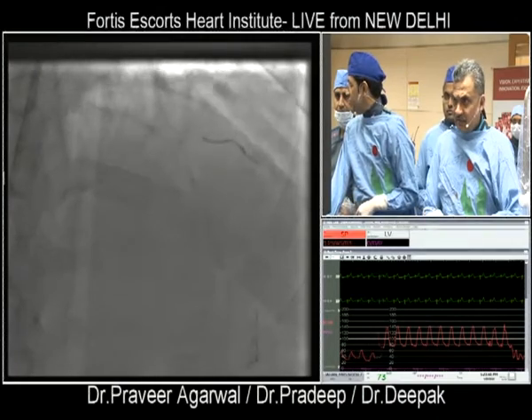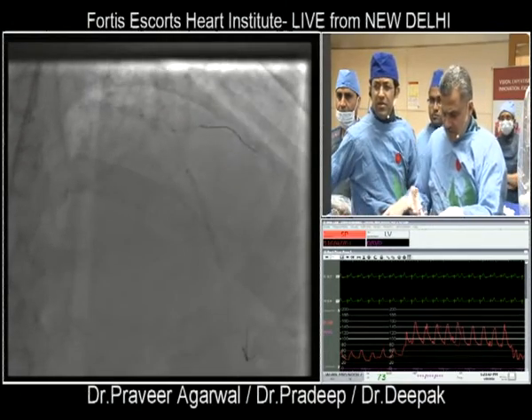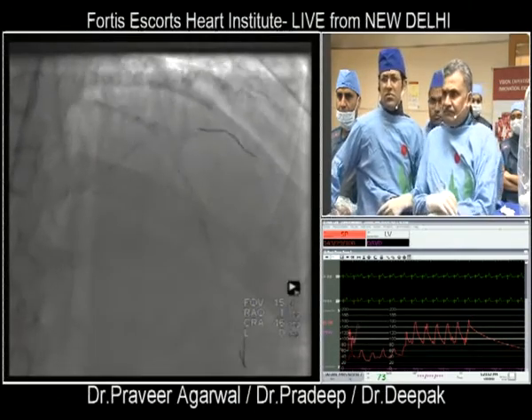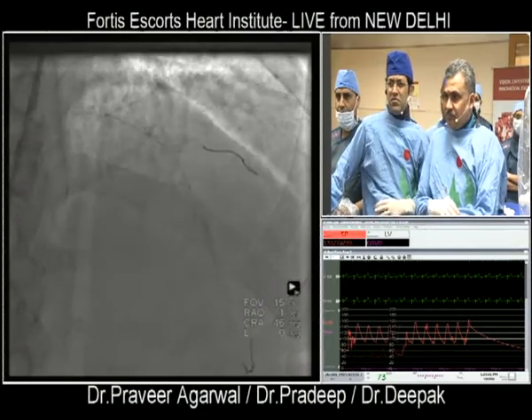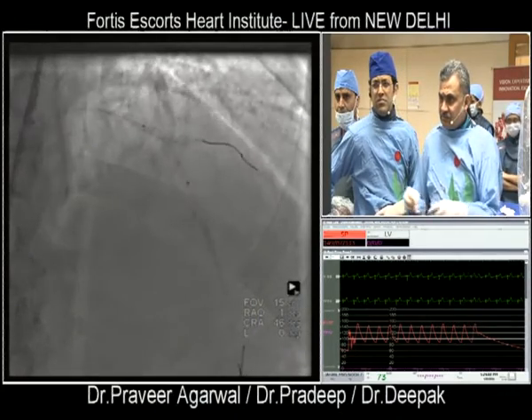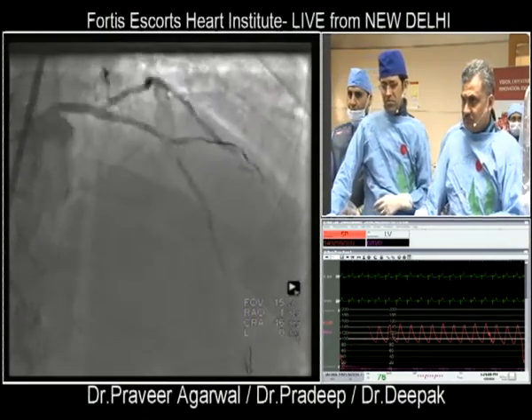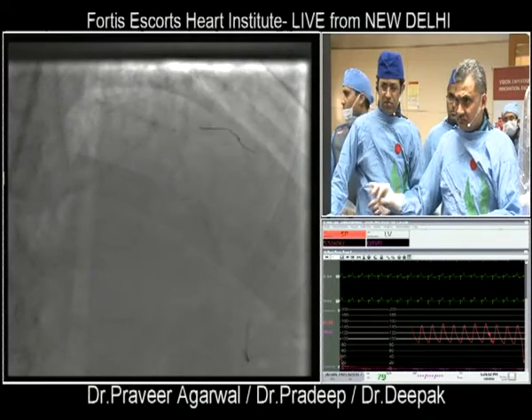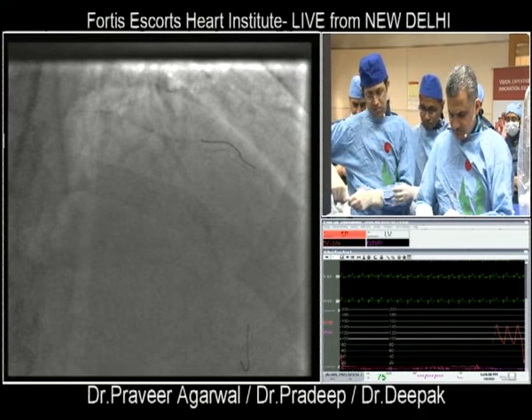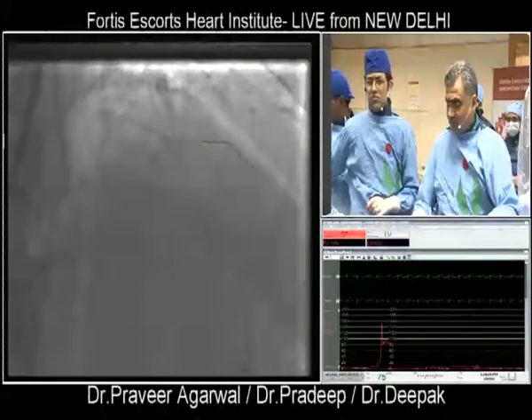Next one here. Now let me take the measurement for the next one. 3.99. So 19 or 24? I think 19 should be enough. Okay, 3 by 19, please. Last shot, please.